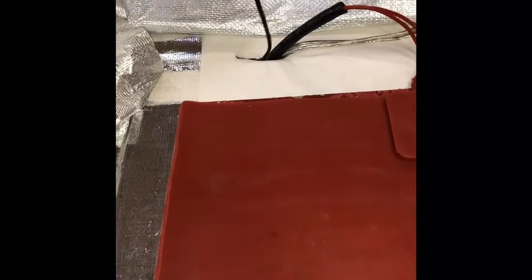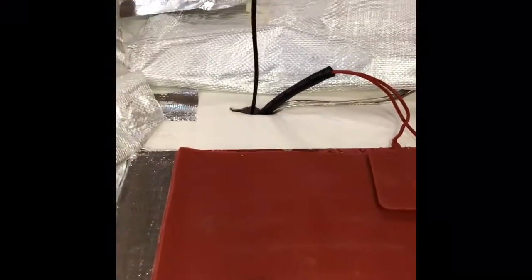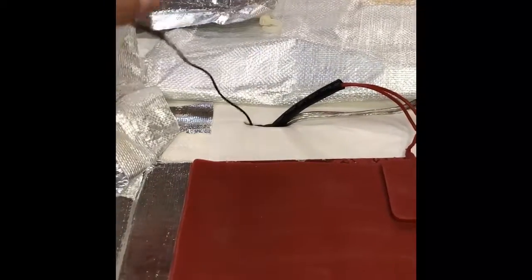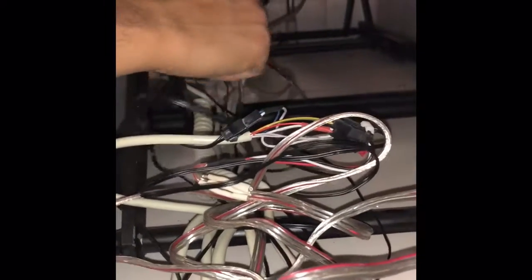We're gonna go ahead and push this down so we can see with the wire. Yeah, it's gonna be better if you do it with two guys. One of them could pretty much be just moving the cable from the top so you could see the cable that it's moving from the bottom. So once this is pushed down, you're gonna see another wire right over here. There's gonna be a couple of wires actually. You just gotta trace that wire from the top.